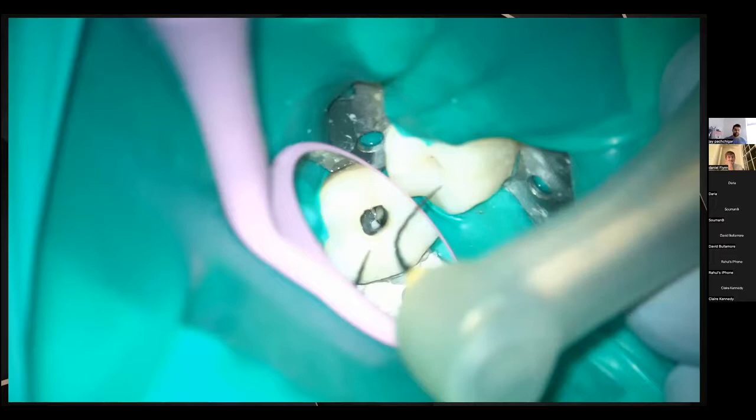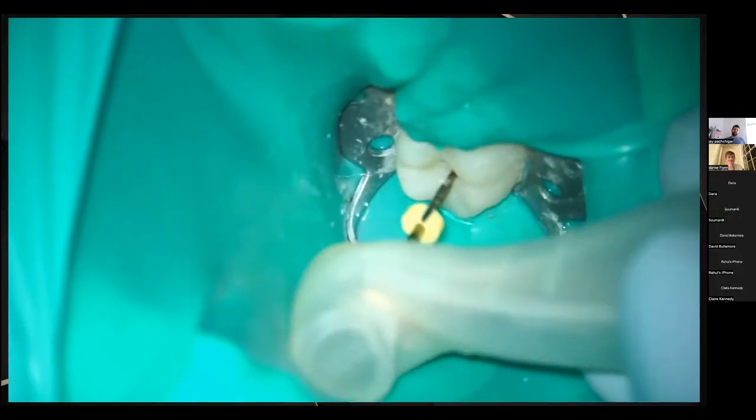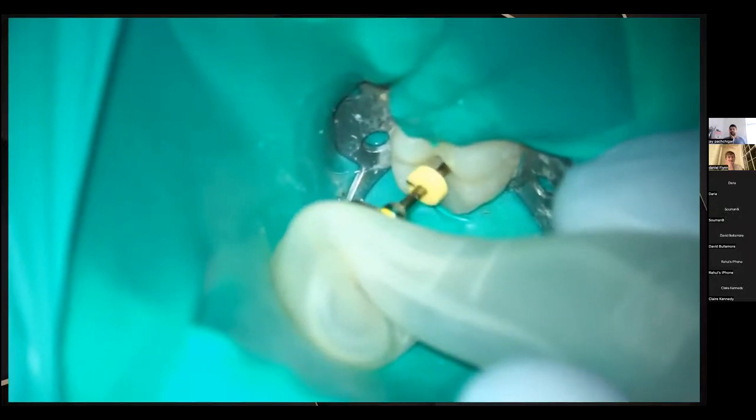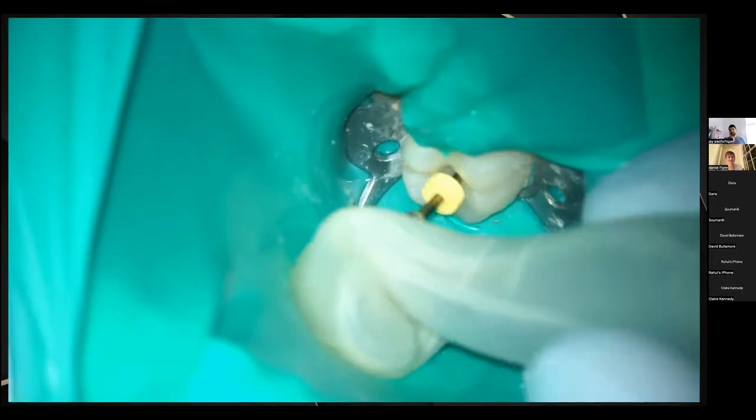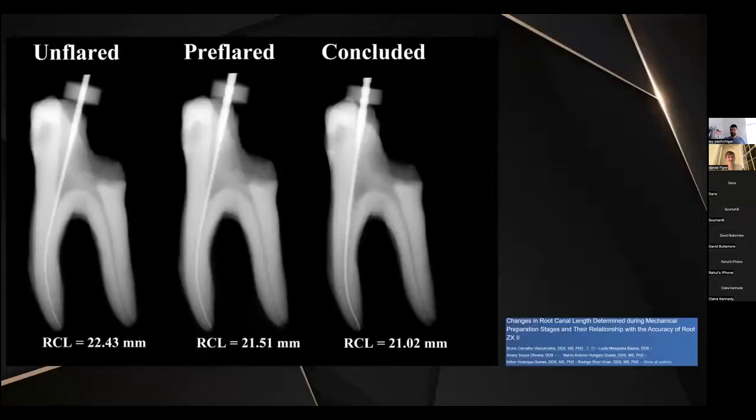I think again, there's probably not going to be any sound with this, but what it's showing is that it just makes my life a lot easier trying to shape these difficult to reach canals, where the patient just refuses to open.